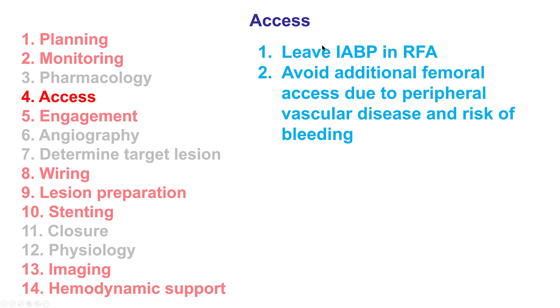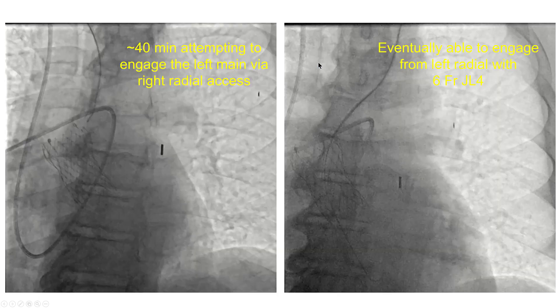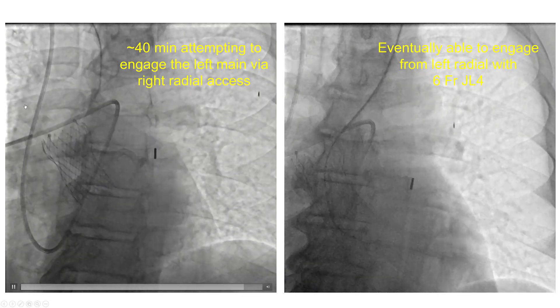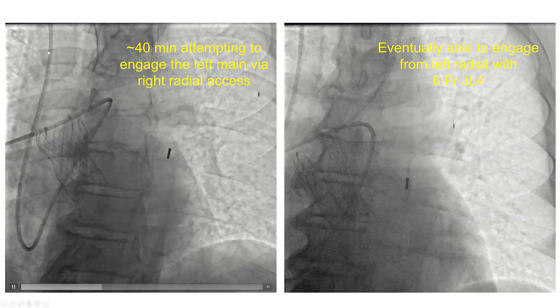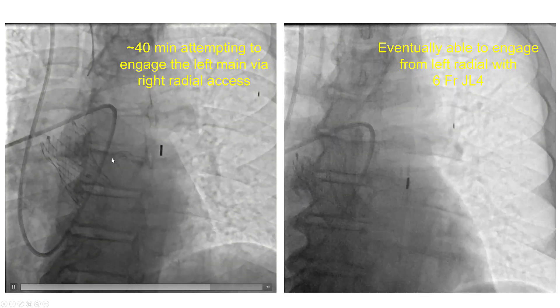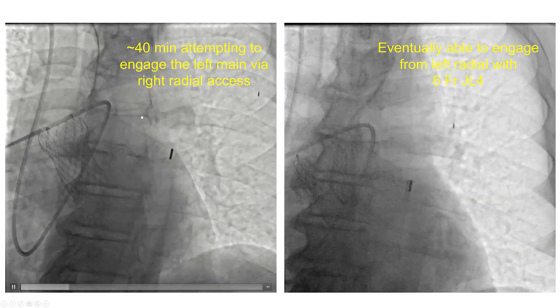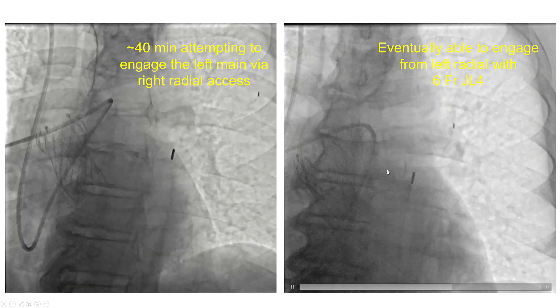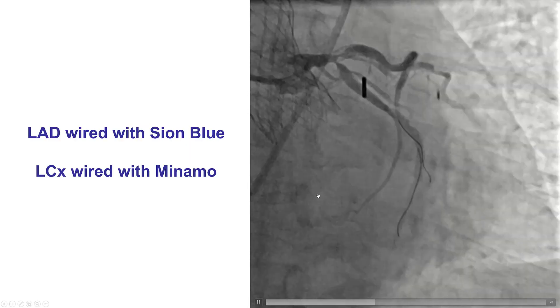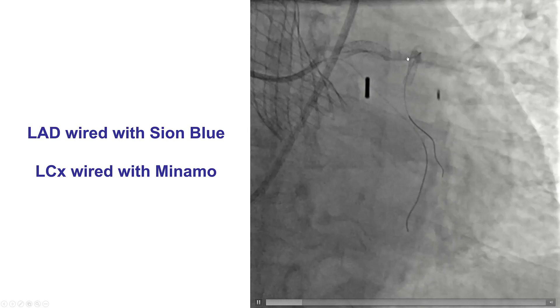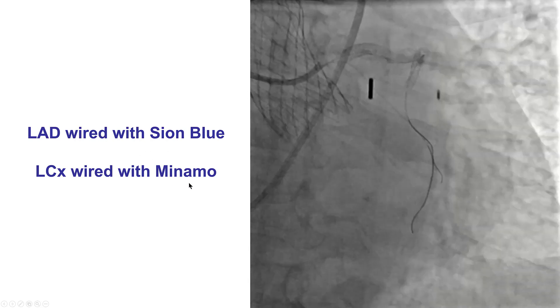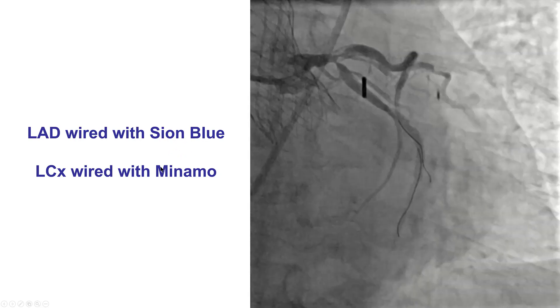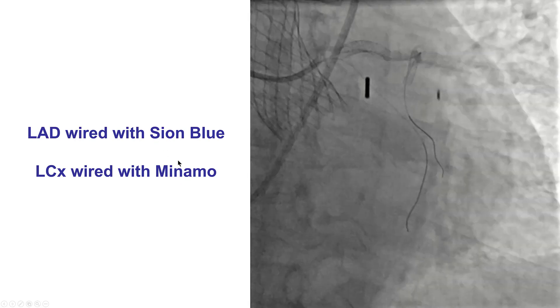Because of significant PAD, we decided to not use femoral access but instead to use the radial approach. We started from the right radial side, which ended up being a poor choice, because after a prolonged period of time we were unable to engage the left main coronary artery despite using multiple catheters. We eventually changed to the left radial and were able to advance a JL4 guide catheter through the CoreValve into the left main. We were able to wire both the LAD and the circumflex with a Sion Blue and a Minamo wire. For bifurcations, we like to use wires with different colors — the Sion Blue has a black color and the Minamo has a green color — so it's easier to differentiate the dual guide wires.